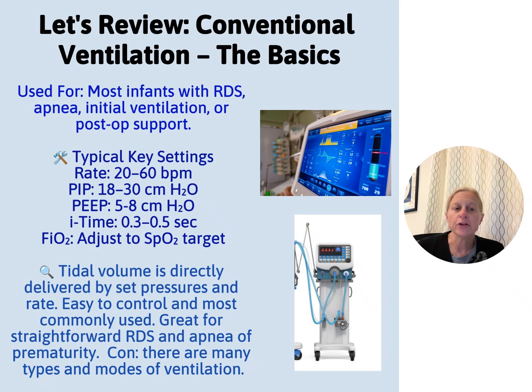So the tidal volume is directly delivered by those set pressures and the frequency of the rate. Depending on your mode of ventilation, again, I work somewhere where we used assist control all the time. I work somewhere where we use volume guarantee all the time, and I work somewhere where we use SIMV all the time. There are many different modes, but which one is set is going to determine how big that pressure is inside the breath, right? How much tidal volume you're getting. So depending on which mode you're on is how you're going to adjust them.